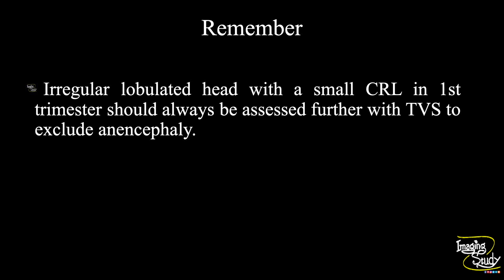Now the take-home message: irregular lobulated head with a small CRL in the first trimester should always be assessed further with transvaginal sonography to exclude anencephaly. This is the first feature you will get in early pregnancy.